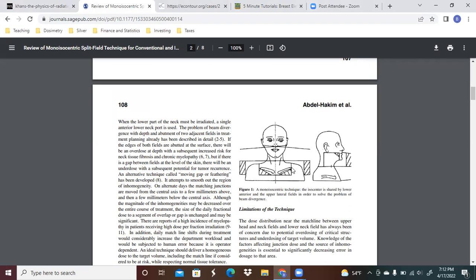Now, as it used to be, 3D planning for head and neck was actually quite simple. And as you look at it today, quite barbaric. You're looking at a monoisocentric setup. In other words, one isocenter for upper beams as well as an S-clav beam down here. You've got a half beam block right here. And on either side up here for either lateral, you may have a little bit of a block over here, but you're trying to expose this particular area here. And then you do the same thing on the other side. And then down here, you've got the S-clav, which is trying to hit certain level of nodes going in here, and then trying to avoid the spinal cord in the back.